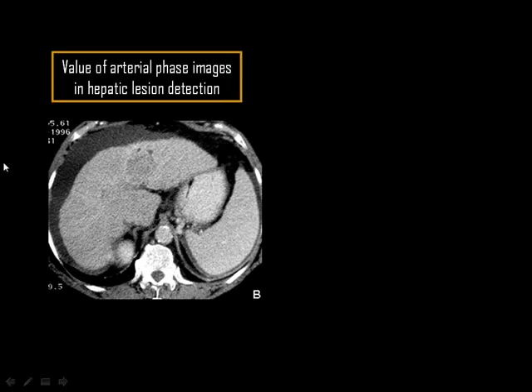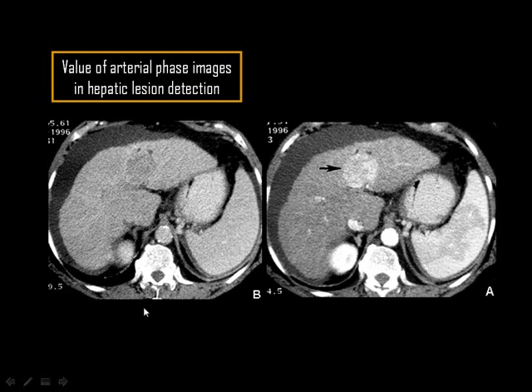And if you look at this patient, do you think this patient is injected with contrast or not? Look at the aorta. Yes. You can see some contrast in the aorta and in the upper pole of the right kidney, for example. And look at the difference. This is the upper pole of the kidney, which is markedly enhanced, and the aorta is almost similar to the bone.